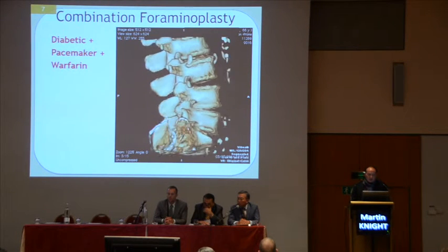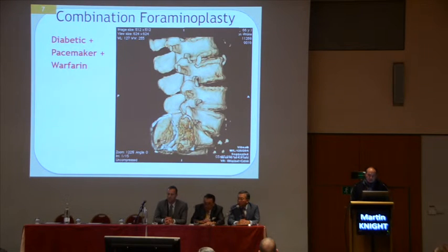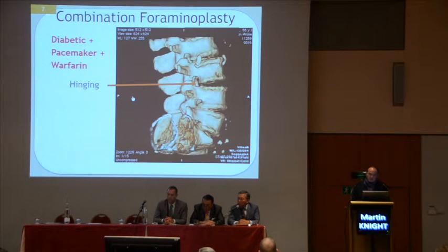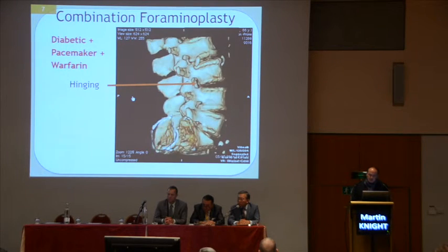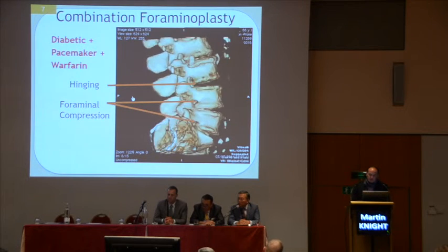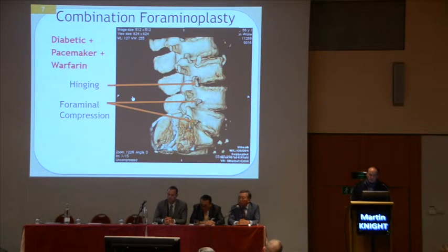Here's a diabetic patient on warfarin, and this is a dynamic CT. And you'll see the patient is hinging at this level, so you'll expect that disc to fail, or also to produce lots of irritation of the nerve in that foramen. And here you'll see the foramina are grossly diminished and pinching the nerve.